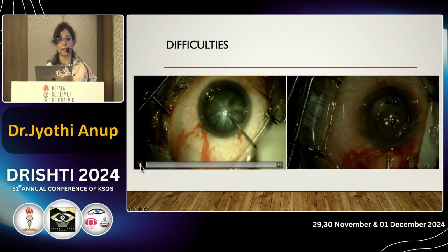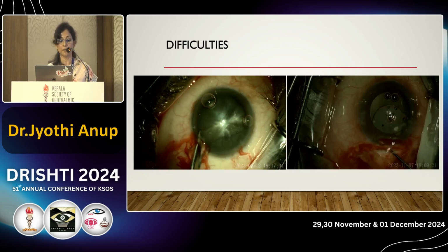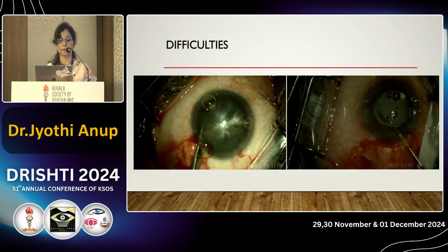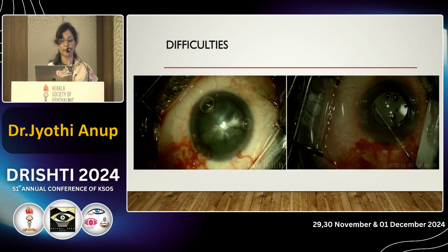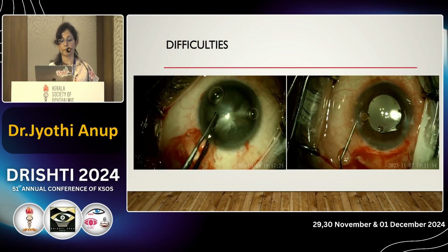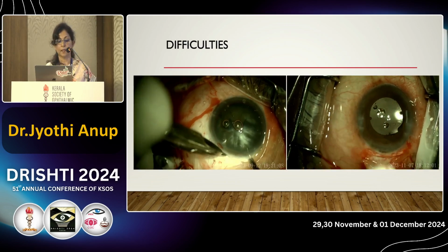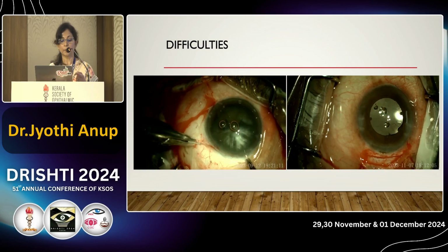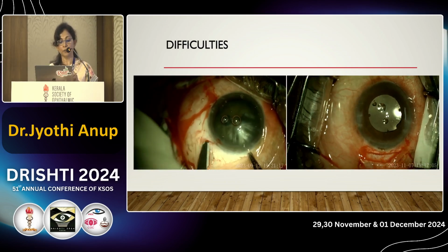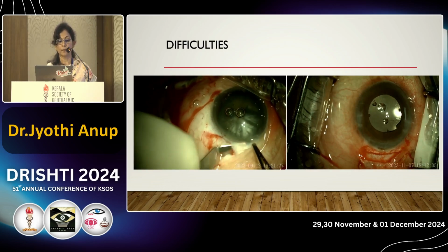Or in the other way, when you experience any unexpected problem in phaco, as you can see a large rhexis tear known as the Argentinian flag sign, don't hesitate to convert. Here it was a clear corneal temporal tunnel, now going for a superior tunnel with a frown incision, and the surgery is completed.